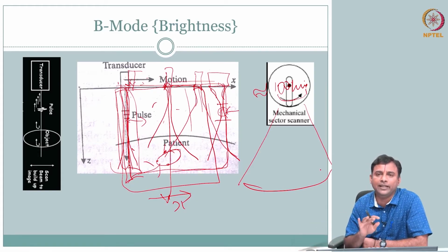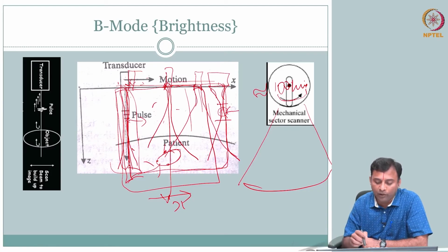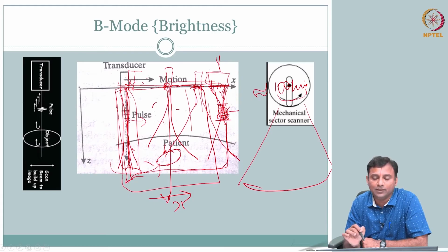The reason I just want to leave it here is that this has a lot of challenges, as you can see. I can have only one focal location because the lens is going to be manufactured with one particular curvature. So I am going to have only one focal depth. If I have a big transducer, I can have a narrow beam, but I am still averaging over all the area to get one thing, and the more wide and more narrow I have, the shorter will be my depth of focus. So my resolution will be spoiled.